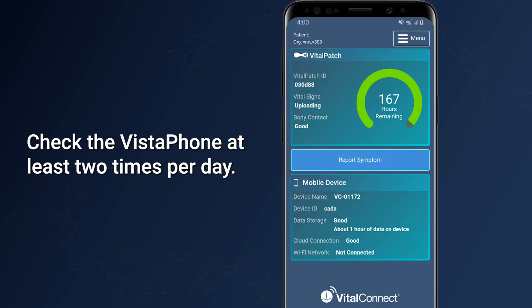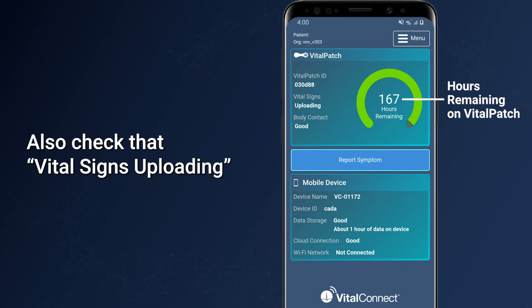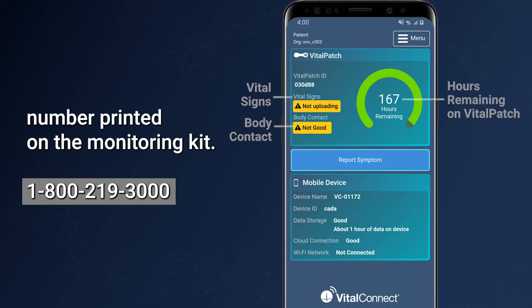Check the Vistaphone at least two times per day. Check how many hours are remaining on the Vital Patch, and also check that 'Vital Signs Uploading' and 'Body Contact Good' are displayed. If these are not displayed, call the customer support number printed on the monitoring kit.